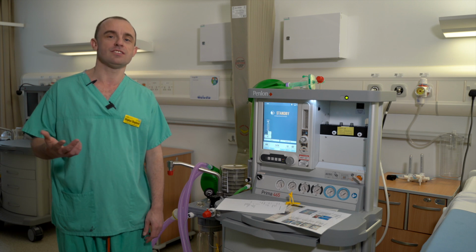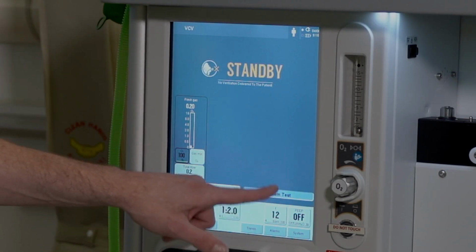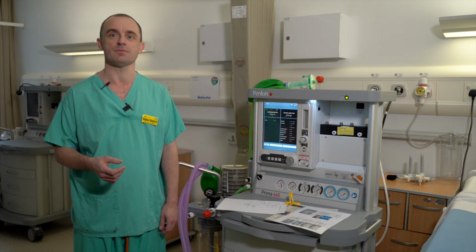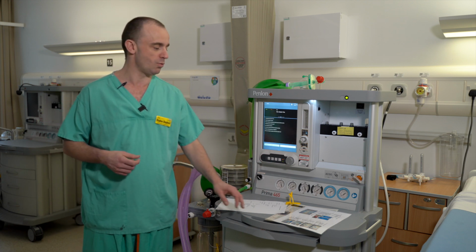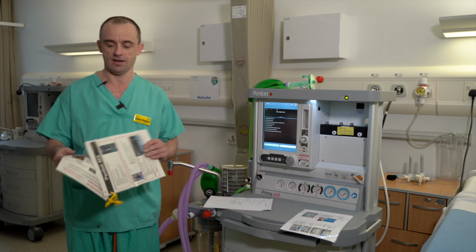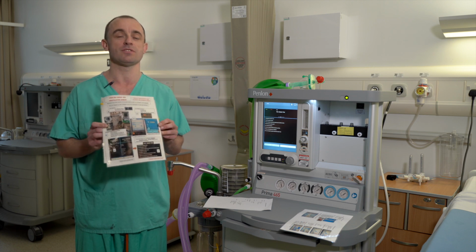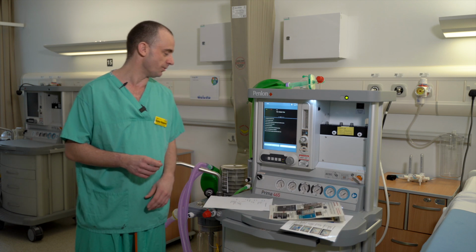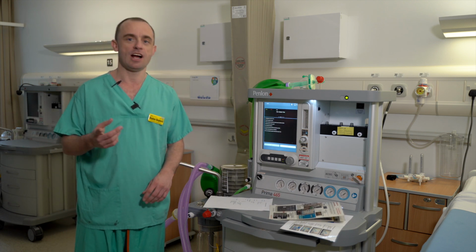Now, the first thing you're going to need to do is a system test. So this is done by clicking the button marked System Test here, and you'll see there is an option here for an automatic system test. If you press that, that will firstly tell you through when it was last checked, but also talk through all the steps that you need. At every bedside, you'll find a card which tells you the exact sequence of steps to help support you in doing this check. So, the first thing it says is going to ask you to switch the bag vent switch to vent. I'll show you this.